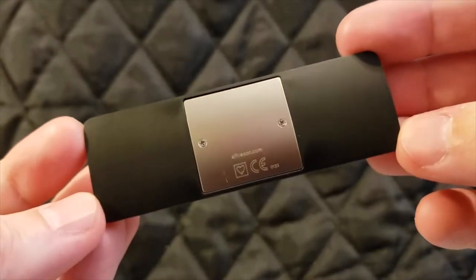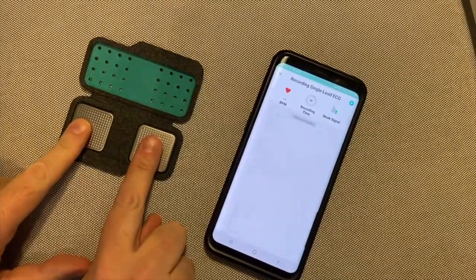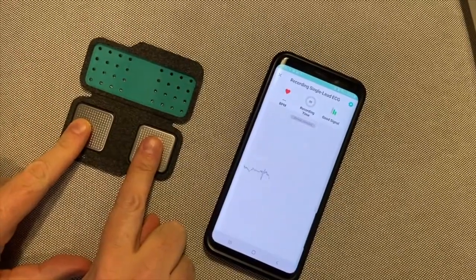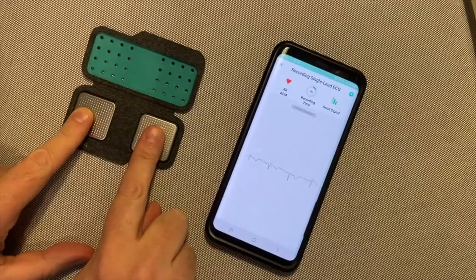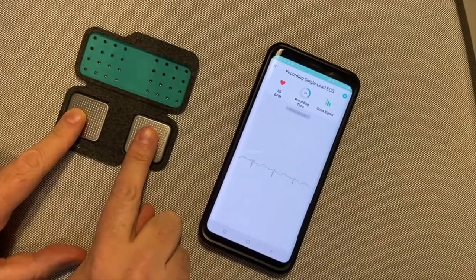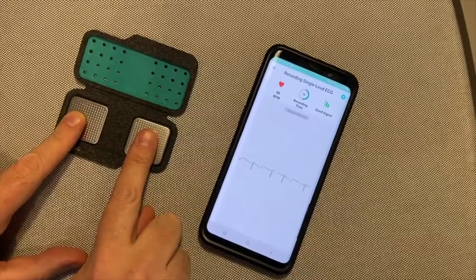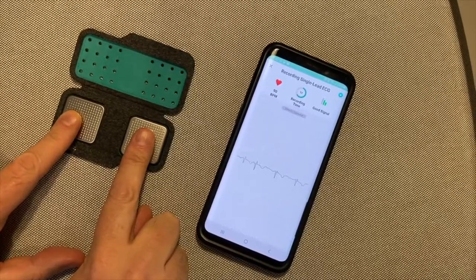I'll show you in the video what it looks like to use the Kardia Mobile Personal EKG Monitor — you just put one hand, or a finger from each hand, on the electrodes. If you've got the Kardia Mobile app set up and ready to go, it will automatically start a 30-second test. It will tell you things like your current heart rate, and it can detect atrial fibrillation, tachycardia, bradycardia, and other conditions.